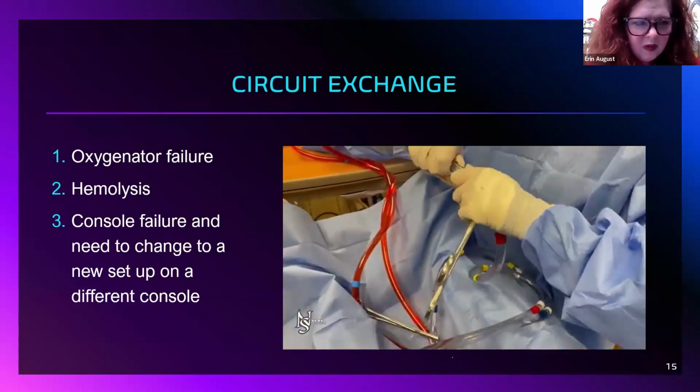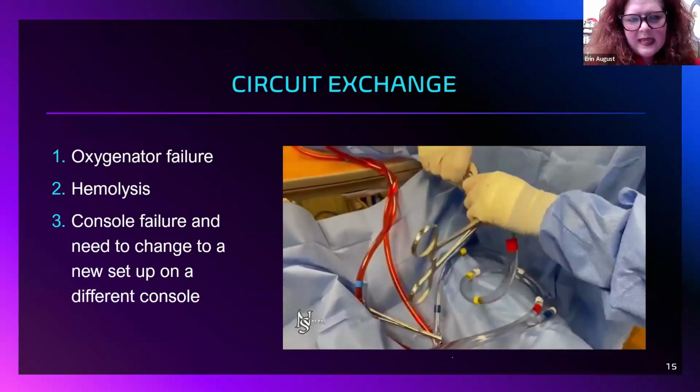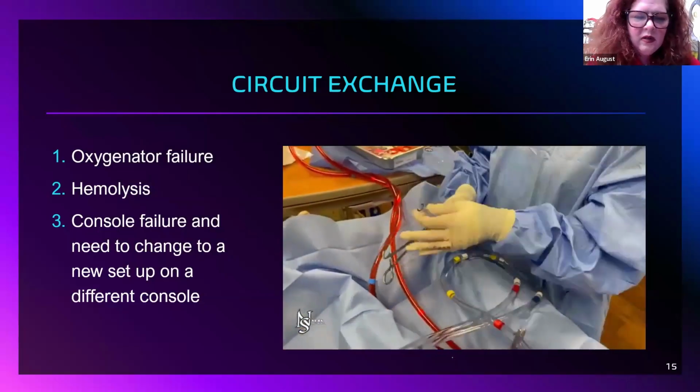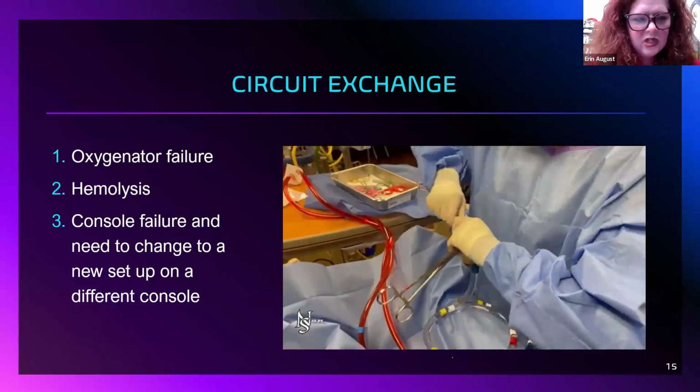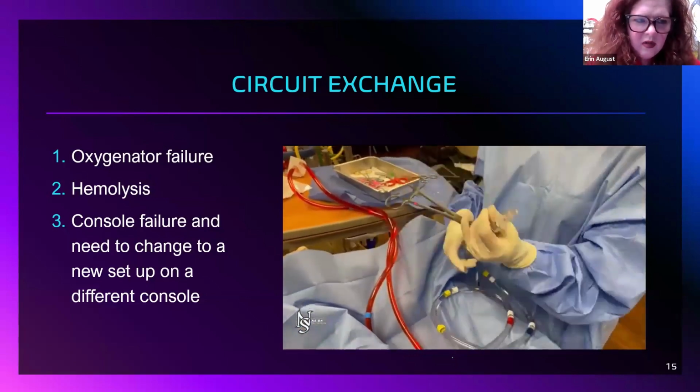And once your team gets comfortable and goes through these steps by step, this is the great time where you can get into timing your staff on how long it takes to cut in a new circuit. How long does it take to cut in a new oxygenator?